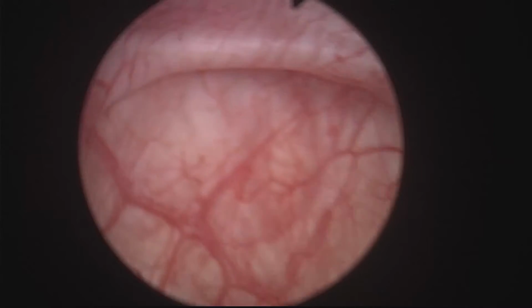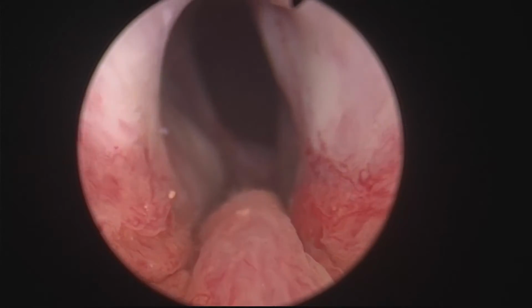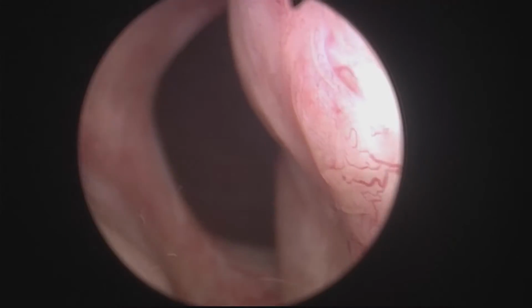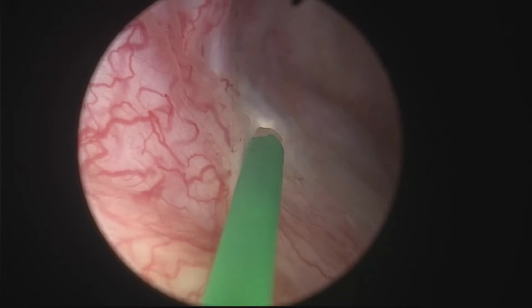And also I told the patient that we could try to do an endoscopic treatment of the diverticulum. This is a possibility for smaller diverticulums. So that's the sphincter. You can see there's residual tissue in the fossa. Some areas were, let's say, resected better than others.